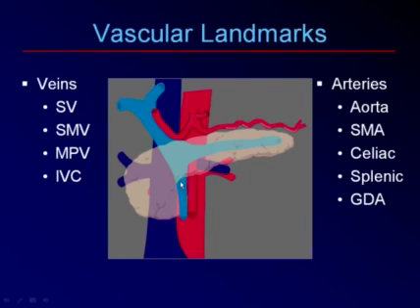travels in a sagittal plane, and the two of them join together in a confluence. So this is a wider area where the main portal vein begins. The main portal vein crosses obliquely in front of the inferior vena cava, which is posterior. Notice here that the main portal vein is located at the superior surface of the pancreatic head, and the pancreatic head is rather long. Here's the uncinate process hooking behind the superior mesenteric vein.